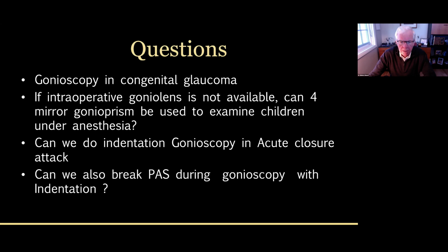Can you do indentation in an acute attack? You can actually break an attack of glaucoma by pushing on the cornea with something small like a four-mirror lens or an applanating tip. People have described doing that, but it's pretty hard to see the angle in an acute attack, partly because of the edema. And can you break PAS? No, I don't think so. A true PAS is pretty tough to break with indentation.